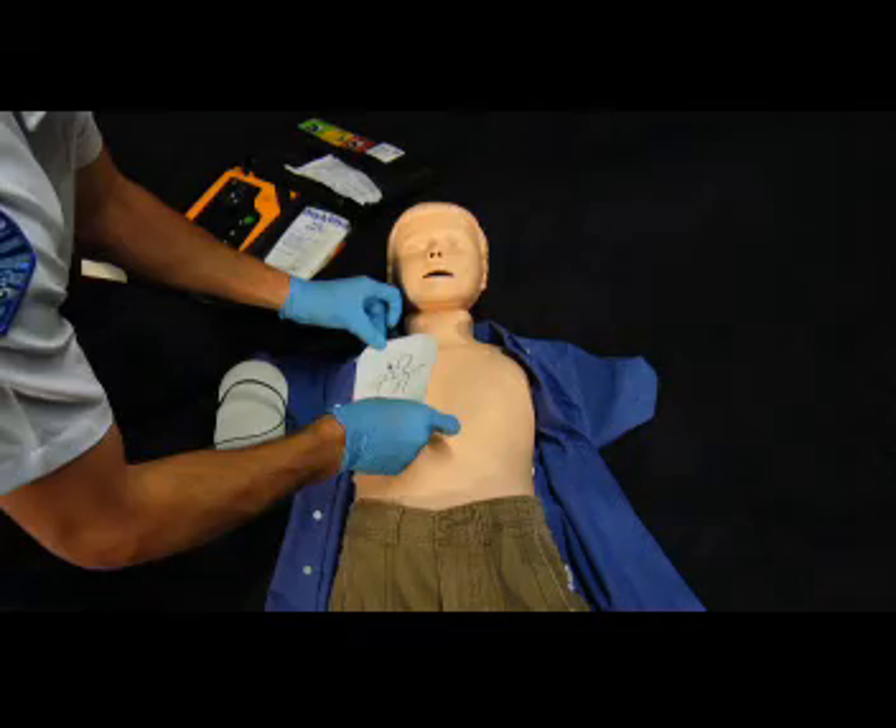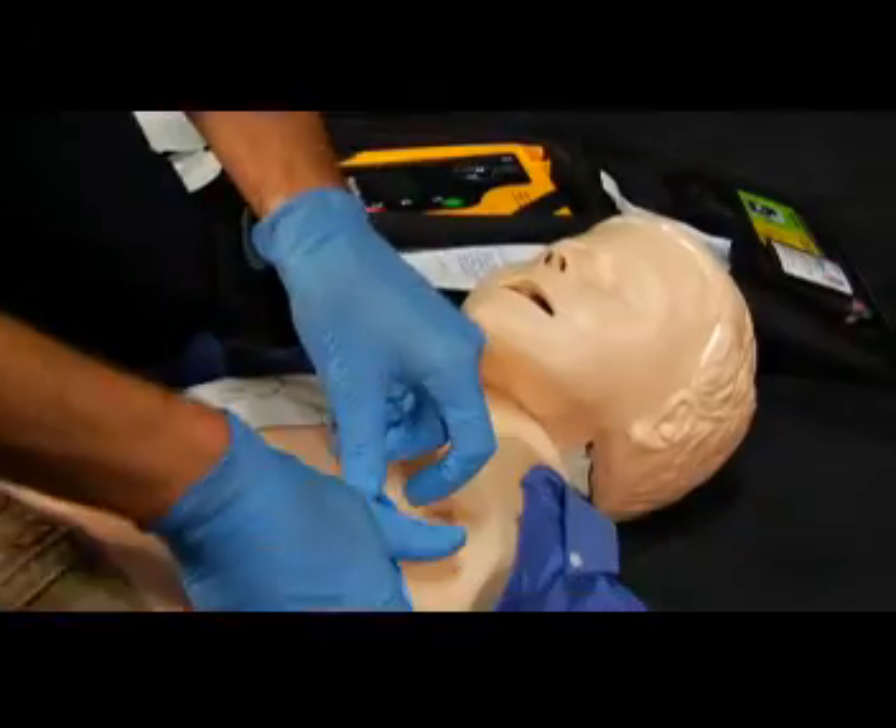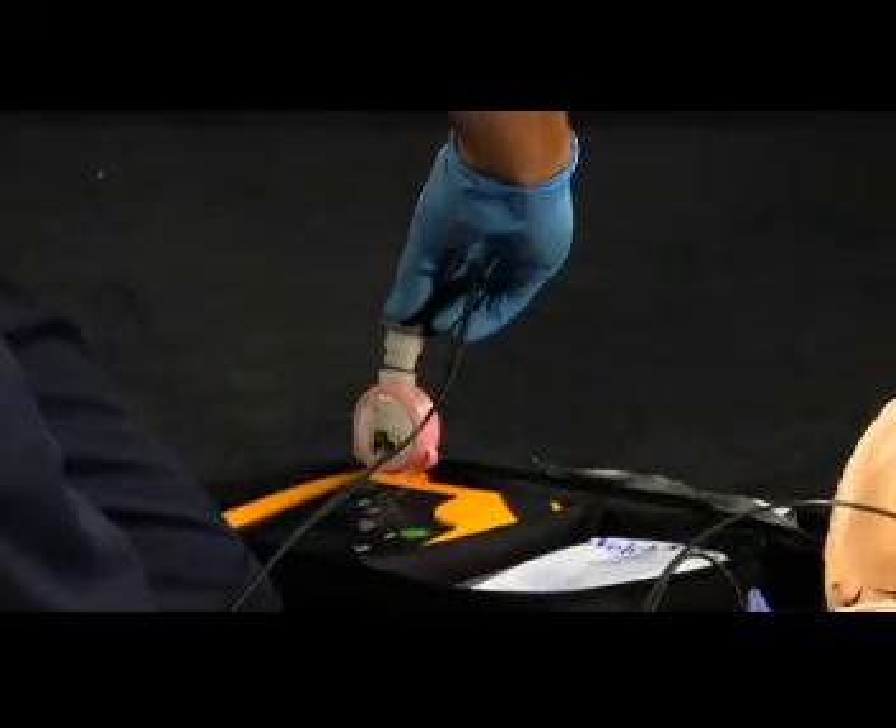The AED can also be used for children. Victims aged one through eight, or weighing less than 55 pounds, require a smaller electrical shock to defibrillate the heart. Some AED models use pediatric pads; others use an energy reducer, switch, or key. If pediatric-specific equipment is not available, use the AED with adult pads.